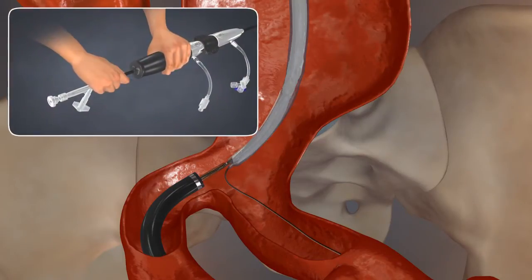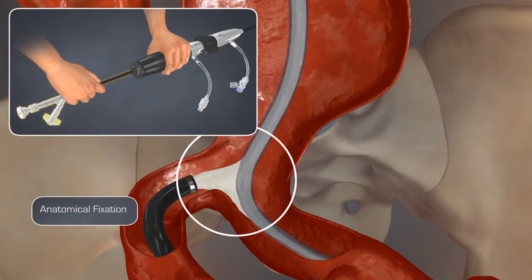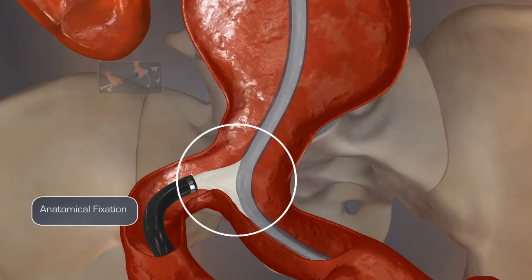Pin the delivery system handle and pull back on the inner core. This motion seats the bifurcated stent graft on the native aortic bifurcation.